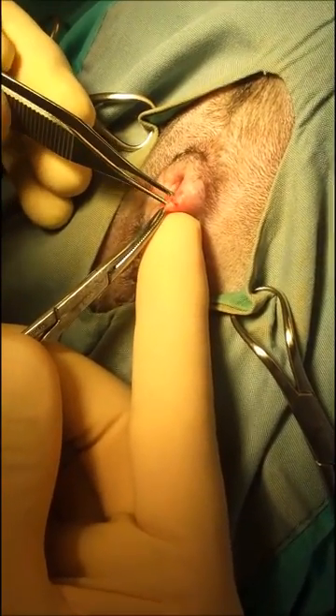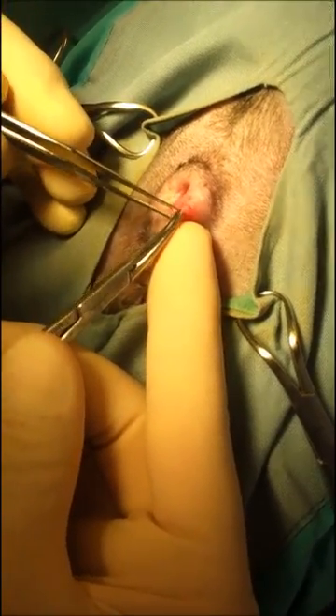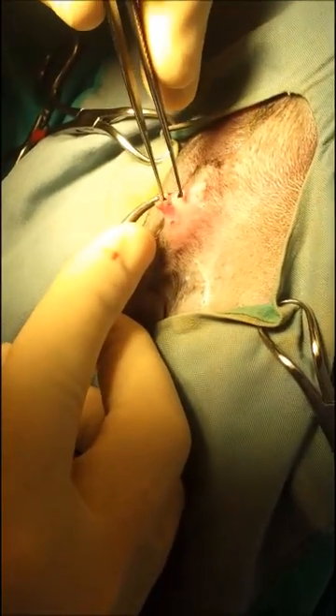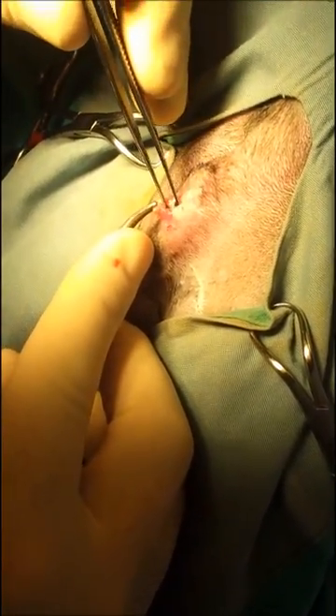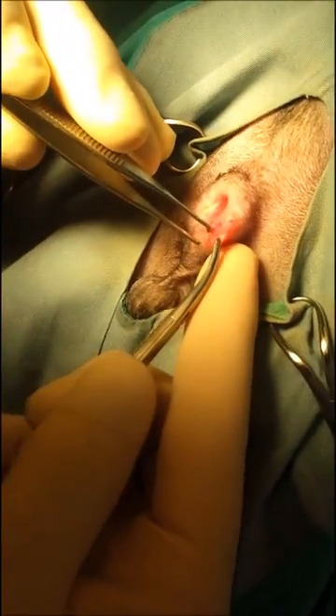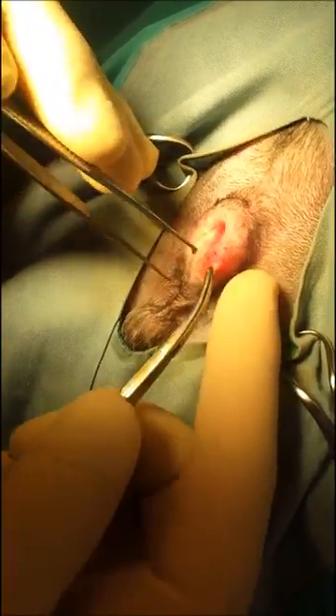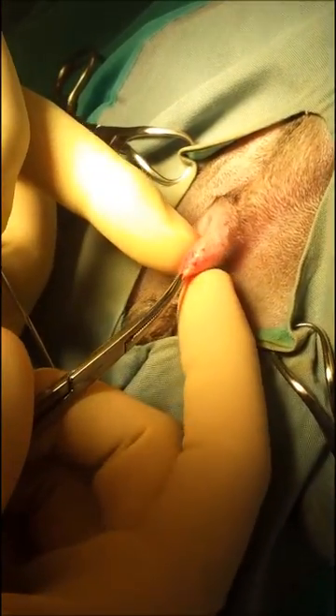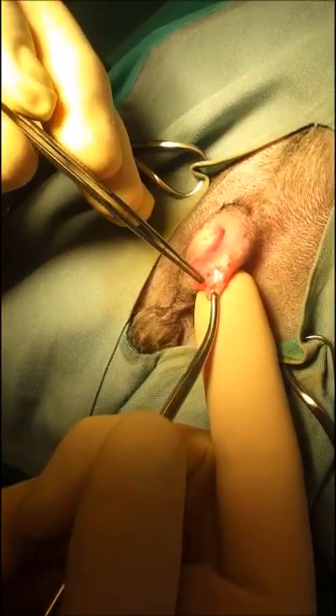Now at this point, this is the hard part. You need to pull the skin away from the duct, which is not so hard. Then you want to identify the gland, which is right here between my fingers — I can feel it. It's right there, and then you're going to see a white glistening tissue.